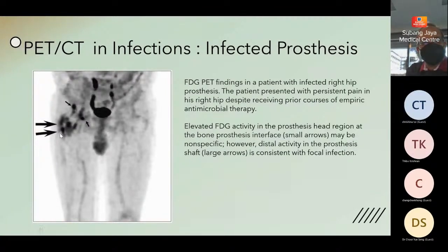But the activity in the femoral area is more intense by comparison. And this high intensity is what can tell us there's infection going on. And this is why PET sort of shines, because we have a semi-quantitative means of analyzing the uptake. We can tell how much uptake is here compared to here by looking at the SUV. If it's more than 30% higher than the rest, then we know an infection is probably occurring there, because they tend to be intense.